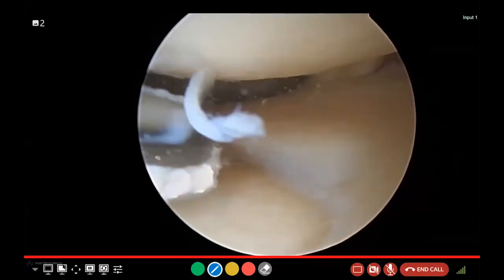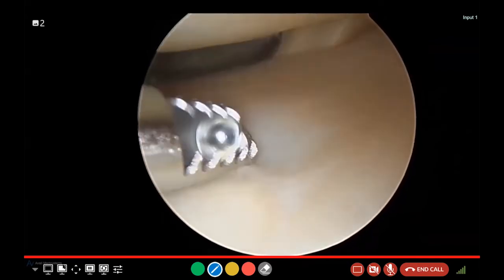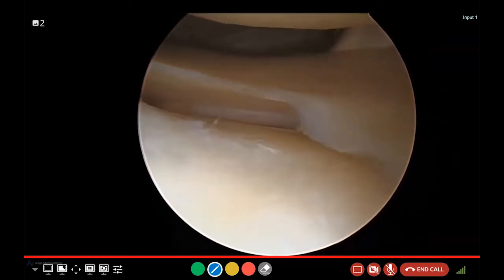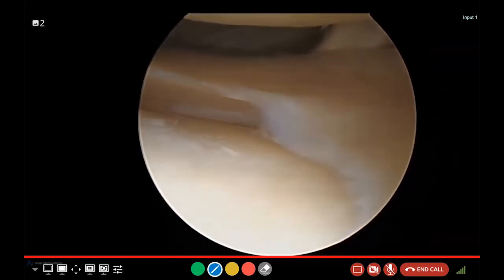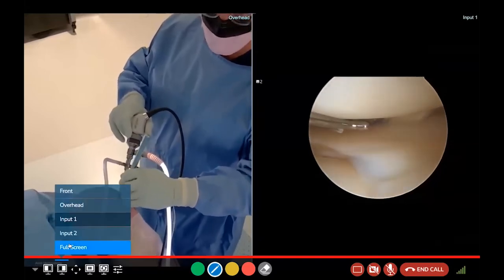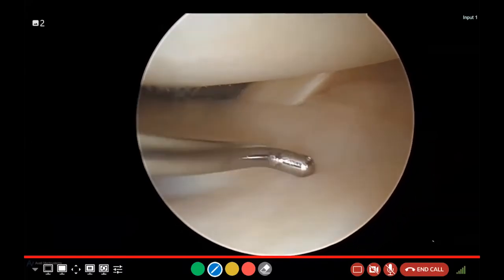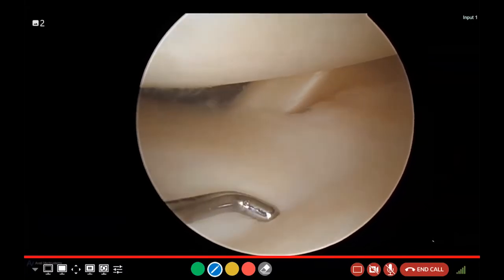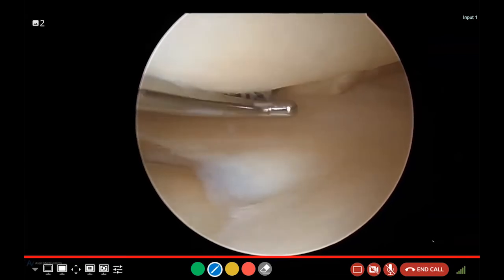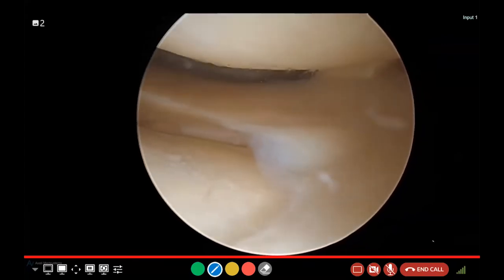There's a question: when would you consider a repair versus a debridement? That's a good question. If you're 18 and had a specific injury, obviously we favor repair. Age and mechanism matter. Most of the tears in this patient population are degenerative, meaning they've been there a long time. It also matters what portion of the meniscus is torn. Up here where the meniscus attaches is the red-red zone — a lot of vascularity. If it tears in the middle, we call that the red-white zone, which has a harder time healing. And if it tears on the inside edge, that's the white zone with really not much vascularity. So the tear has to be in a young person with no arthritis and closer to the attachment of the meniscus in order to have a chance at repair.